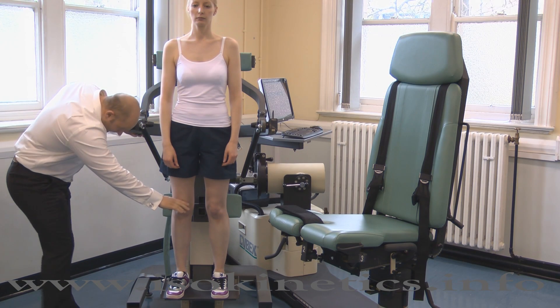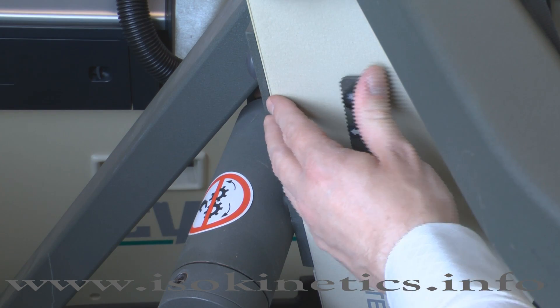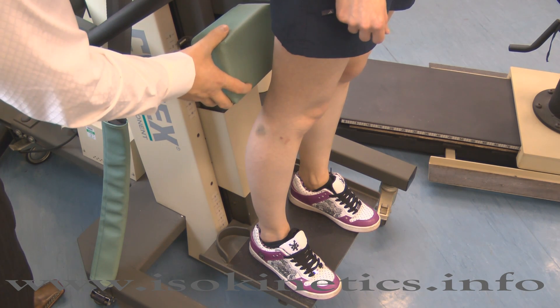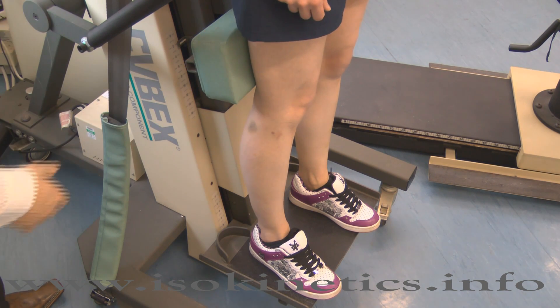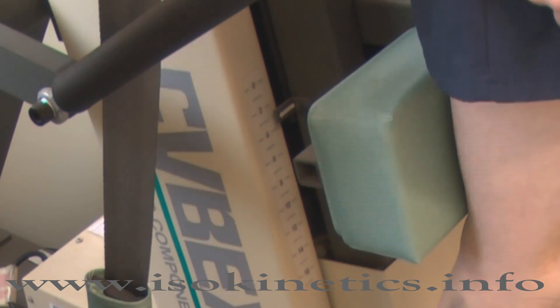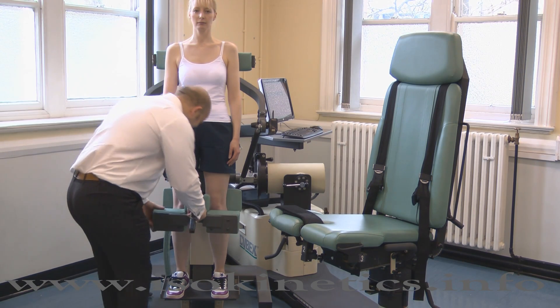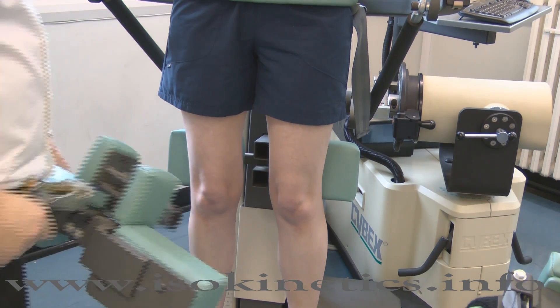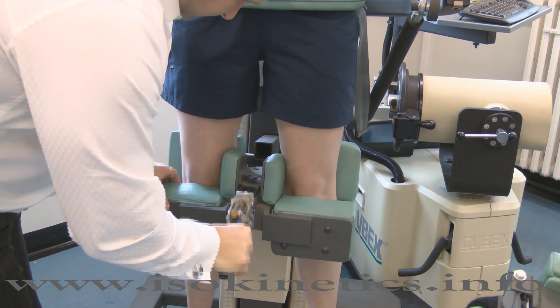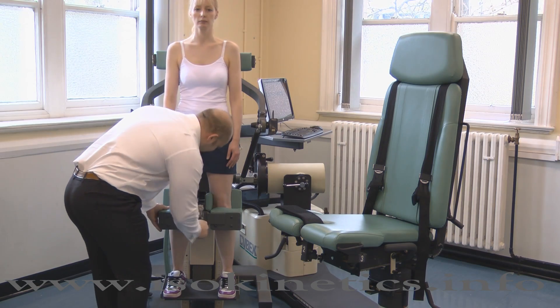Adjust the height of the thigh stabilizer by pushing the switch forwards with one hand and adjusting the height with the other hand. Adjust until the pads are directly behind the kneecaps. The height of the stabilizer can be seen here. Now place the calf pad into the lower receiving tube on the thigh stabilizer. The handle should point downwards; the calf pad should hit below the patella. If not, adjust the thigh stabilizer and begin the procedure again. Secure by pressing the handle downwards.